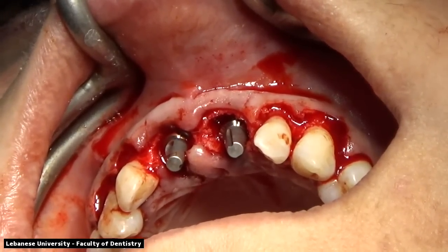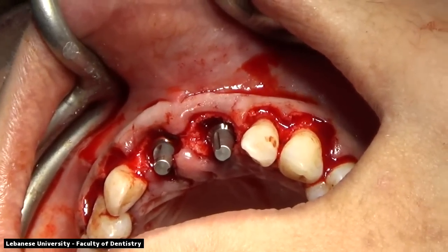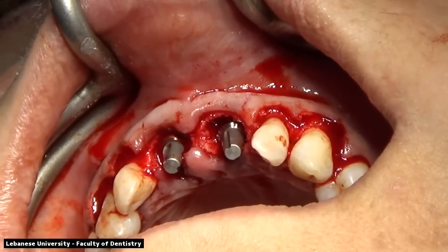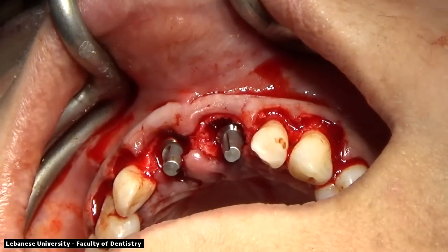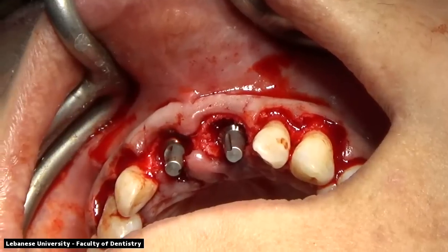We are going to prepare right now for placement of our bone graft material. A particulate bone graft will be placed to fill the gap between the implant and the buccal plate of bone. This will prevent the collapse of the buccal plate of bone during the remodeling of the bone after extraction.